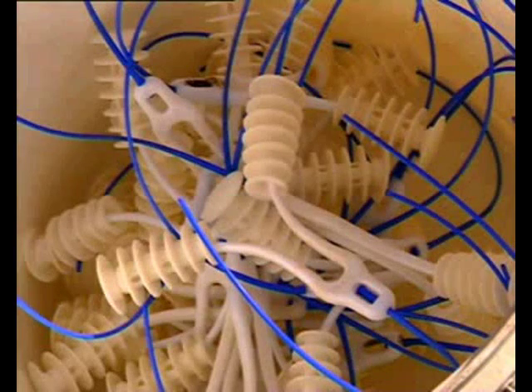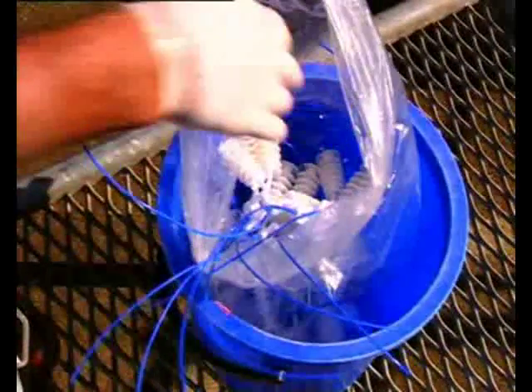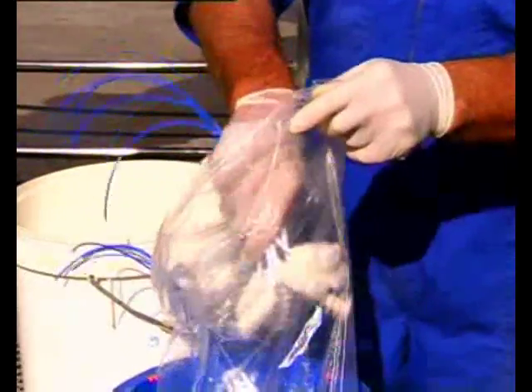For reuse insertion programs, take the used Q-mate, wash as before with a high pressure hose, and soak devices in a veterinary sanitizer for 30 minutes. Allow to dry and store the Q-mates in a sealable plastic bag, ready for reinsertion.